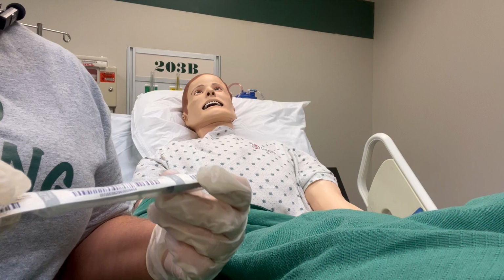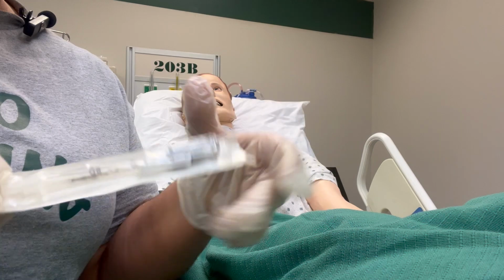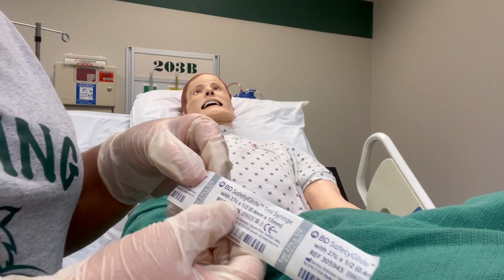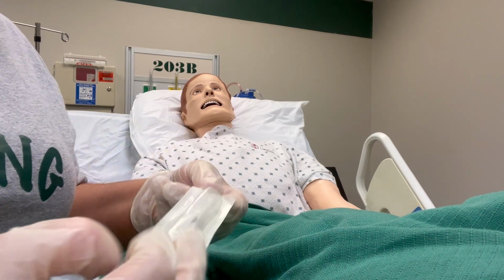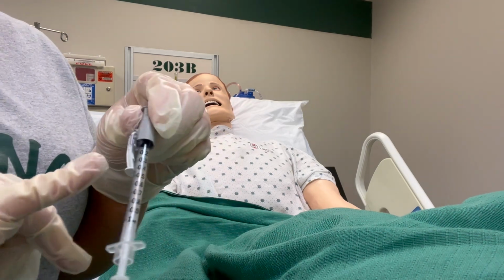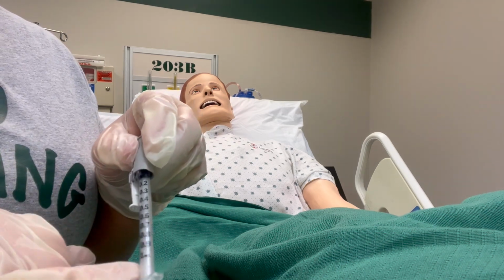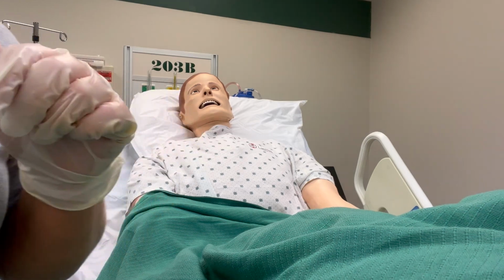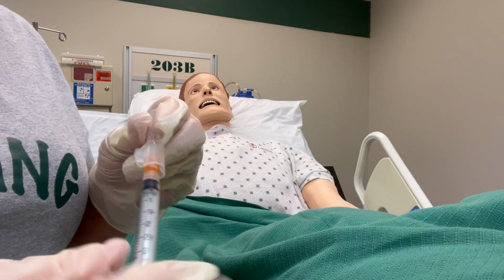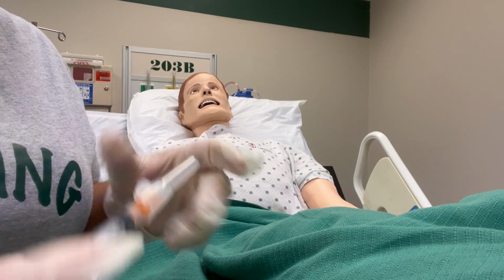A lot of times for heparin, or other non-insulin medications, we may use what we refer to as a TB syringe or tuberculosis syringe. Those are the syringes that are gray, because they have a very small needle. You can see this is a 27 gauge, 1/2 inch. It allows us to very easily draw up small amounts of medication. This is labeled by 0.1, 0.2, all the way to 1 ml, so we can do a very small dose, as opposed to something like this 3 ml, where we can't do as minute dosages.